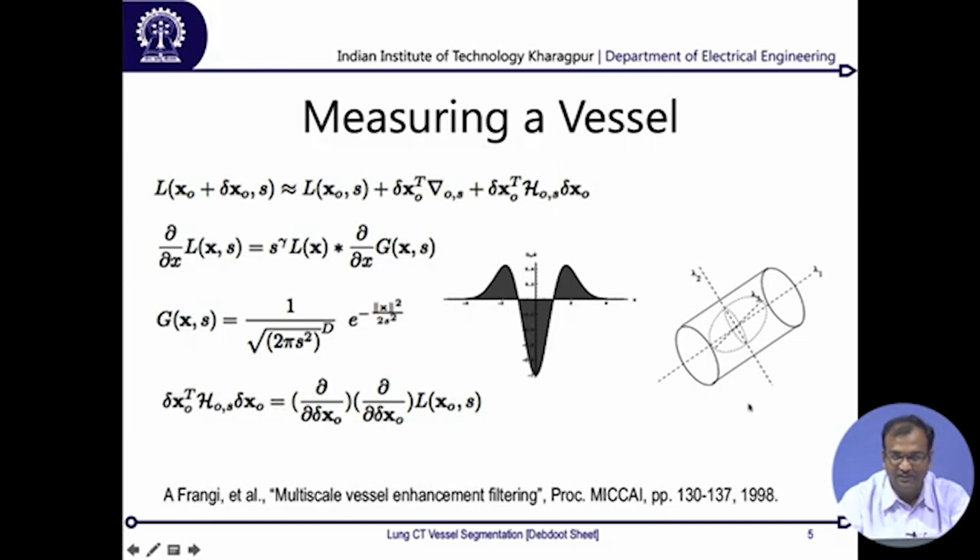In essence, what would come out is a factor which looks something like this. Say that there is a cylindrical structure, like your blood vessels, which in the 3D space are obviously in a small piece of volume. You would see a piece of a cylinder. Now if I am traveling along the length of the vessel, then I would just be seeing these small cylinders going down along the length of the vessel. I take one small volume over there, in which I will be getting a piecewise cylinder.